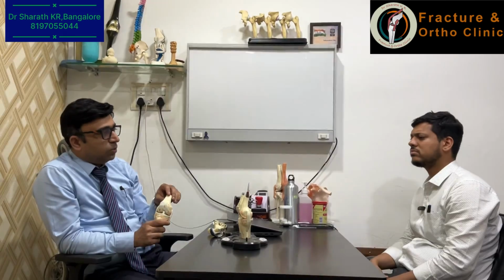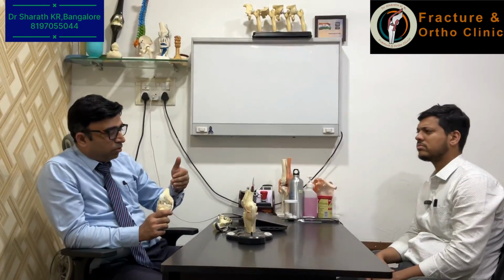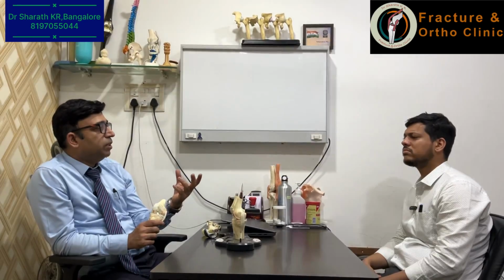Second, someone in whom the deformity is very much, laxity is very much, the knee is too damaged and there is so much bone defect. Our planning of sizing of the implants and our planning of balancing will be very easy when we take the help of the robot. In simple words, if there are more deformities, or if there are implants already inside, it makes our surgery easier.